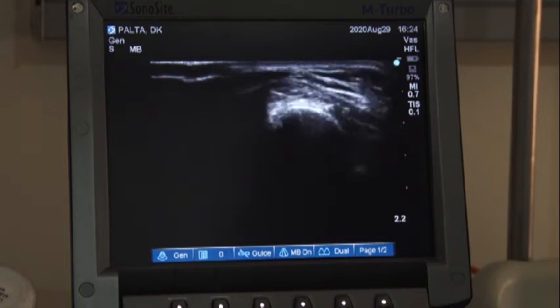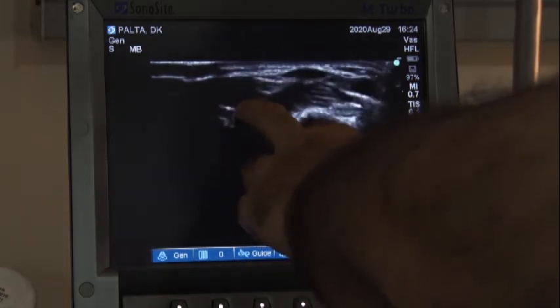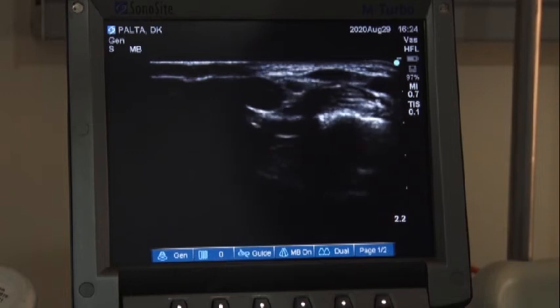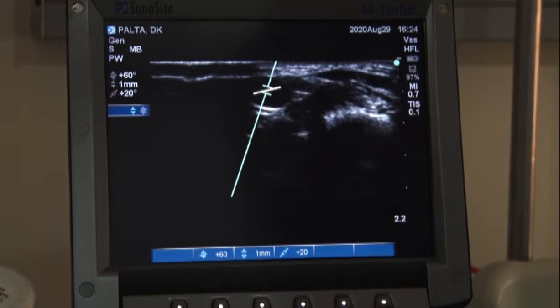See, what is happening? So this vein is dividing into 1 and 2 veins. So half of this is taken by one vein, half is taken by the other vein. Even there are 3 veins.